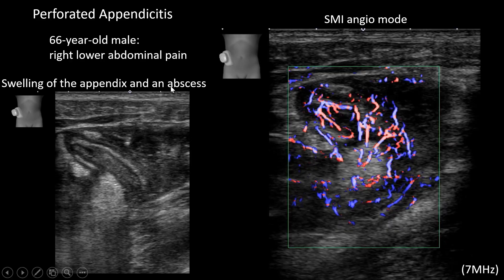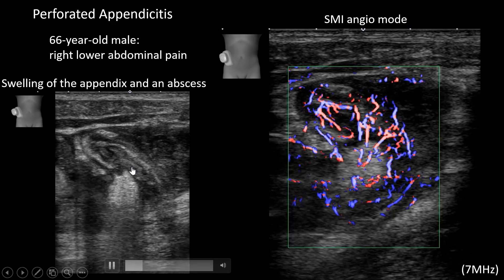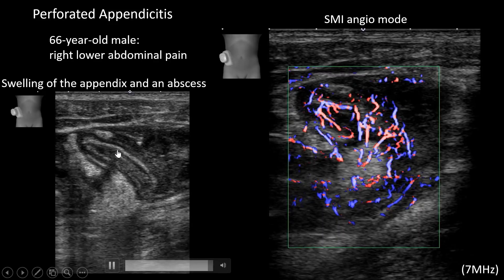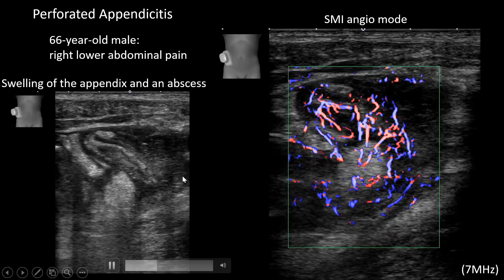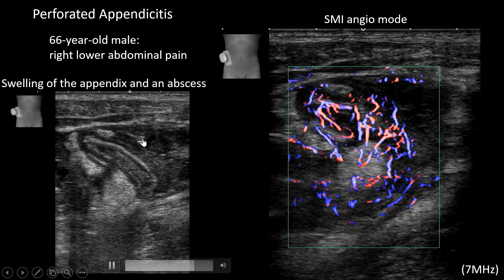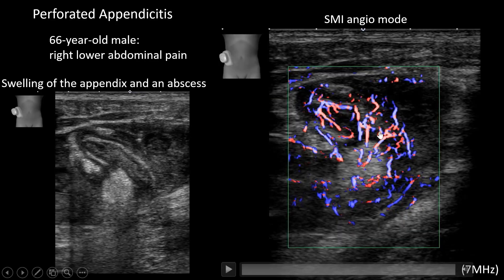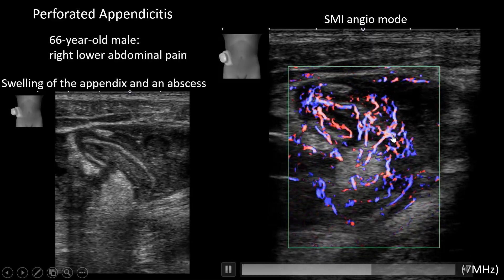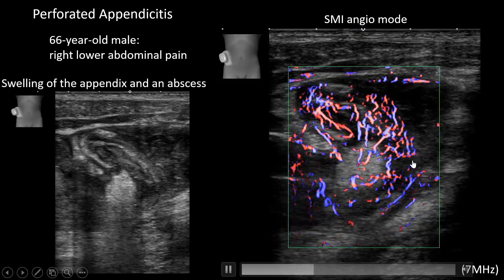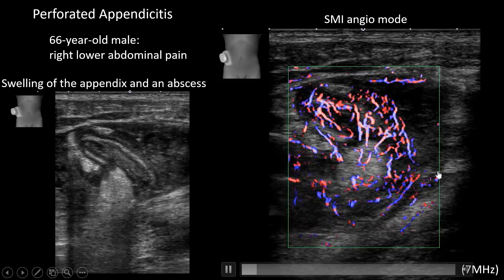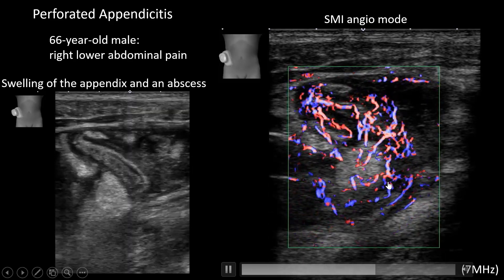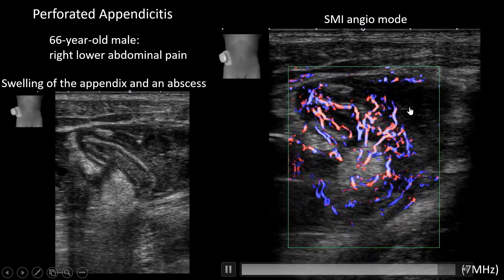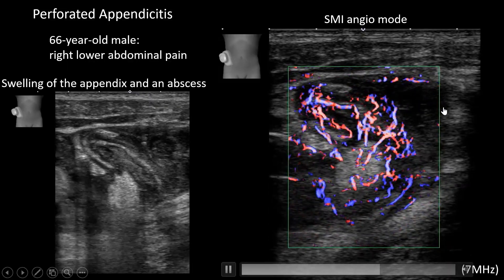This is a case of perforated appendicitis — a 66-year-old male complaining of right lower abdominal pain. You can see the swollen appendix and an adjacent abscess, but on conventional imaging you cannot tell exactly where the perforation is. By using SMI Angio Mode, there is hyperemia throughout the appendix except for one avascular area, which is the site of the perforation. The adjacent area, about two centimeters in diameter, represents the abscess.